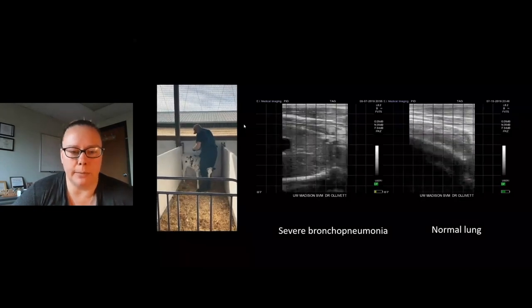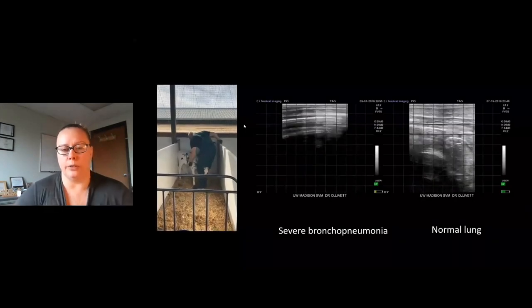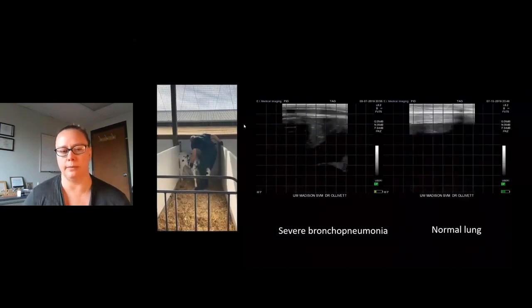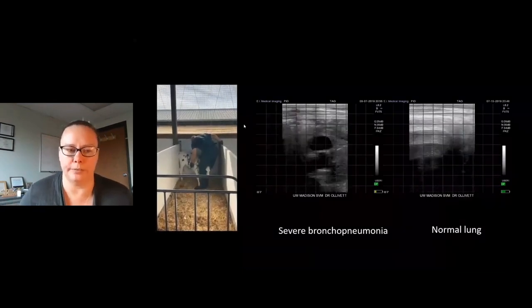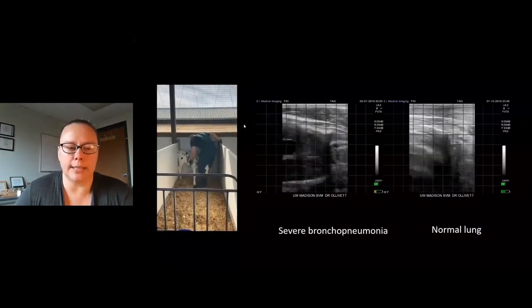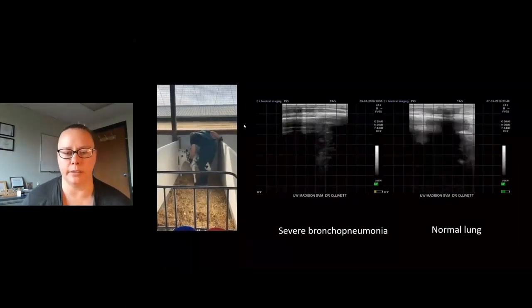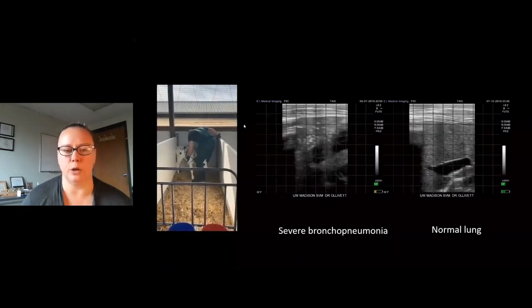I expect to be able to scan about 30 to 40 calves an hour without a helper. With a helper, you can be up in the 70 to 80 calves an hour. This is a tool that's meant to be fast and meant to be done on large groups of calves in a short period of time. Okay, so we just get that calf in the corner, put some alcohol on the side of its chest, and then we use our ultrasound, the same ultrasound that your veterinarian uses to diagnose pregnancy in a cow. So using that rectal probe.